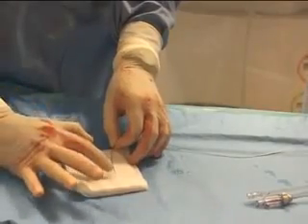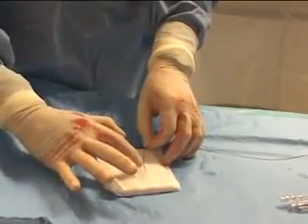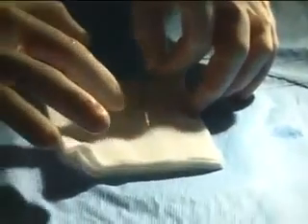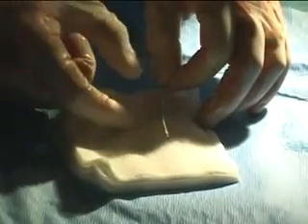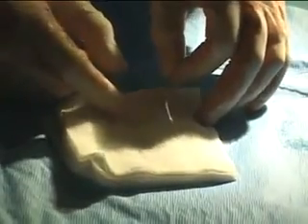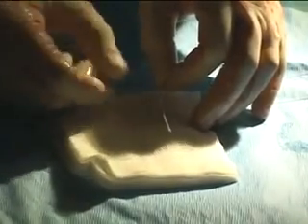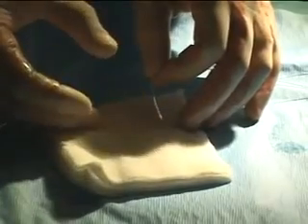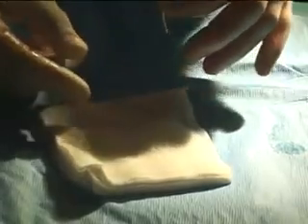So you can see the stent material, which is a stainless steel or a cobalt chromium alloy. They're the 2 different stents that we now use in coronaries. And the stent is crimped on a balloon. You can't really appreciate the balloon, but it's under there because it's uninflated. What we will do is we'll put this stent in the artery over that wire, and then we will inflate the balloon, which is under the stent, and that'll deploy the stent into the wall of the vessel, and then we will deflate the balloon and pull the balloon out, leaving the stent behind in the vessel.